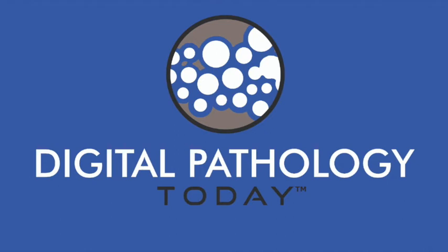So are you looking beyond NASH, really, to apply this to all cases in histopathology or many more applications? Yes. I mean, the short answer is yes. We have been using the same technology to look into fibrosis of the liver, the kidney, the lung, bone marrow. There are easily about 20 applications, different parts of the body, that we look at using the same technology. A different AI, of course, because every organ has its own specific AI algorithm that is machine learned and trained to quantify the tissue from that particular organ, and even looking at fibrosis in tumors as well.